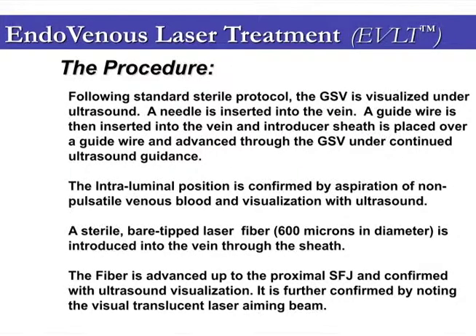Endovenous laser treatment is performed using a standard sterile protocol. The greater saphenous vein is visualised under ultrasound. The needle is inserted into the vein, followed by a guide wire. An introducer sheath is then placed over the guide wire and advanced through the long saphenous vein under continued ultrasound guidance. The intraluminal position is confirmed by aspiration of non-pulsatile venous blood and visualisation with ultrasound.